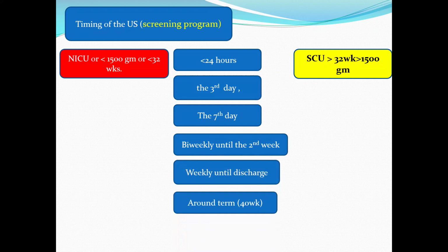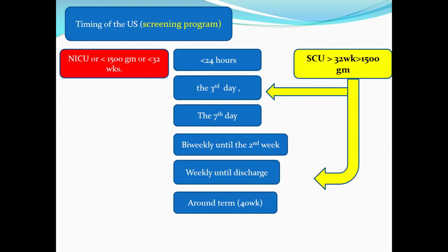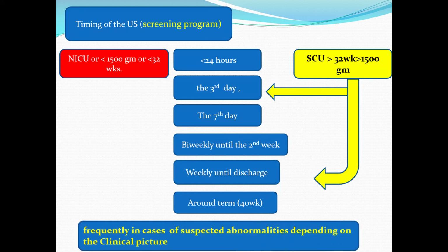Neonates on special care unit who are low risk, more than 32 weeks, or more than 1,500 gram, we will start from the third day, then weekly until discharge. Ultrasound may be frequently repeated in cases of suspected abnormalities depending on the clinical picture.